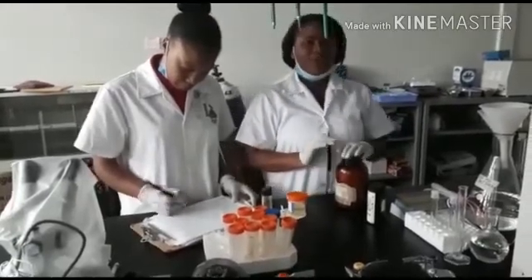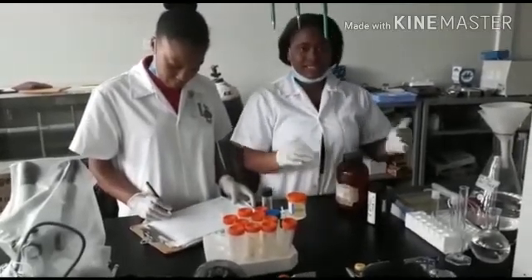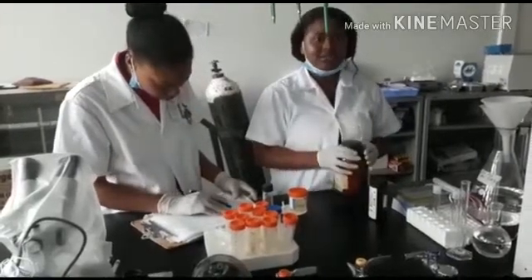After the 24-hour period, the specimen is bottled and an ice pack is placed inside the box that is going to be sent to the lab because, as I said before, the urine has to be refrigerated. The specimen bottle is placed on top of it and it is closed and sent to the lab to be tested.